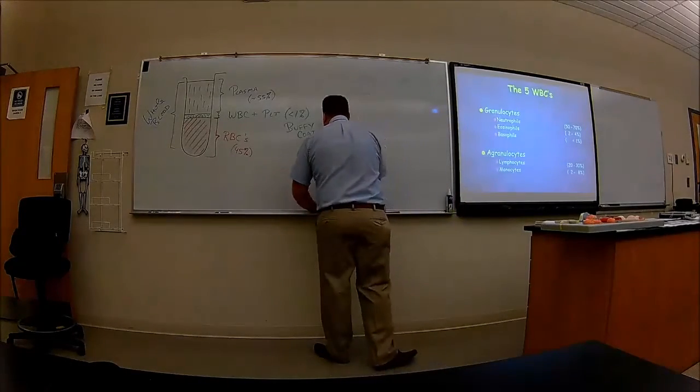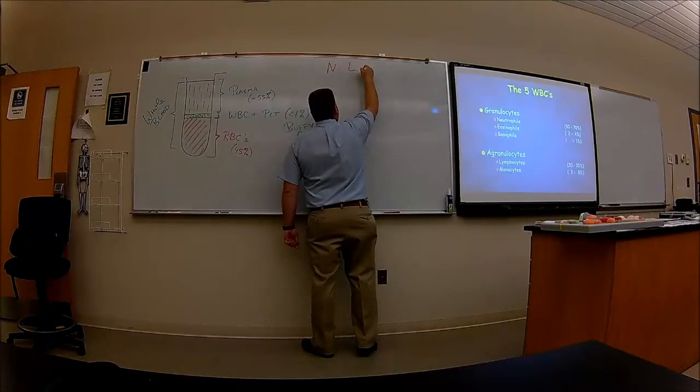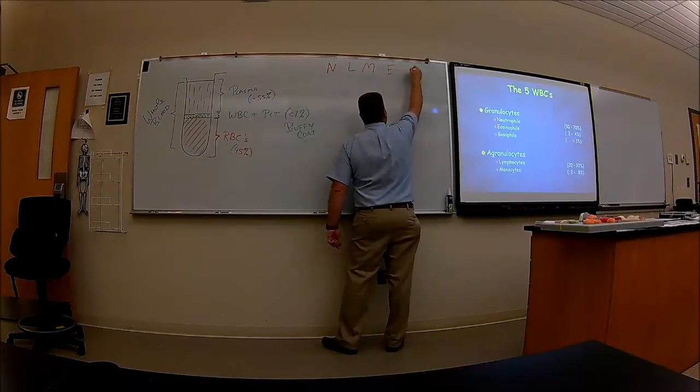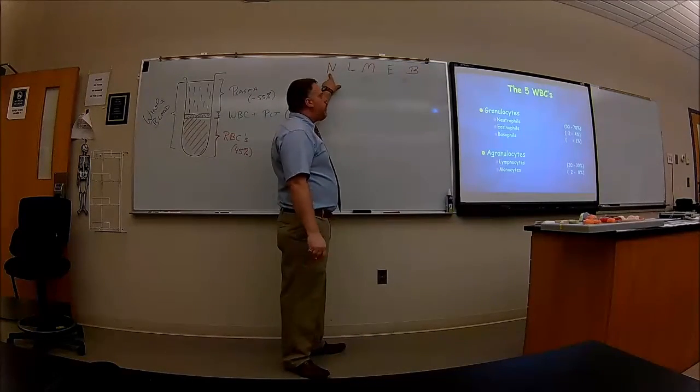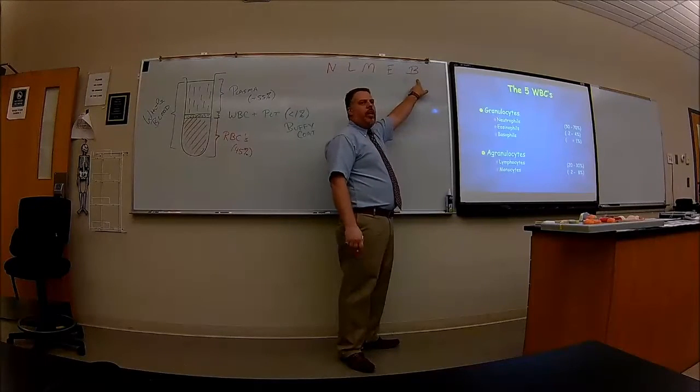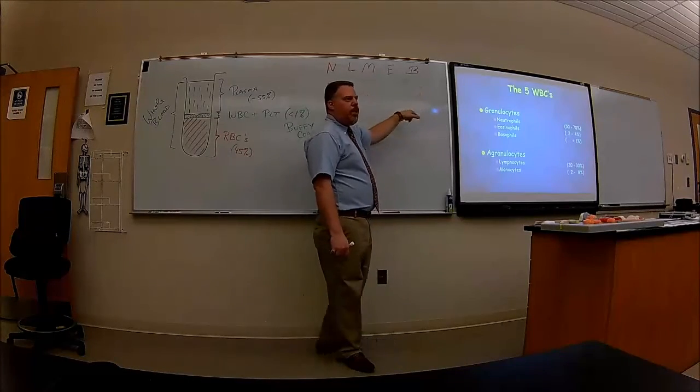So here's a few mnemonics to help you. Never let monkeys eat bananas. Most numerous neutrophils, you'll be lucky to find one of these. This is less than 1% of the white blood cells. Okay? Never let monkeys eat bananas.